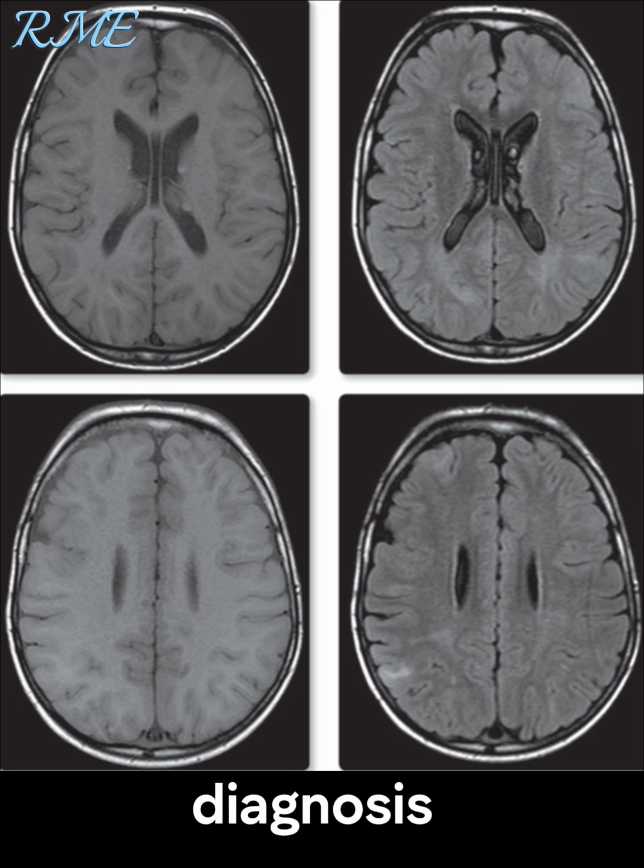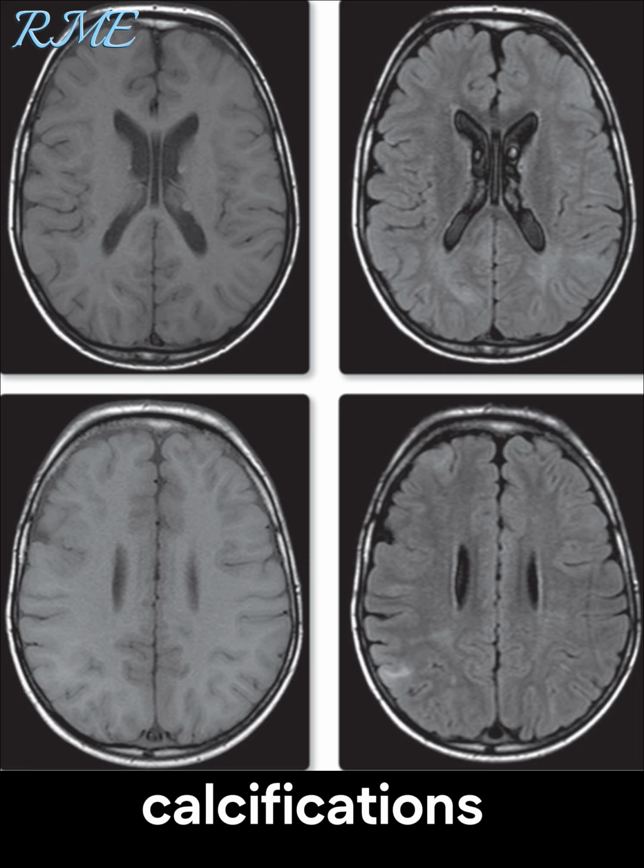The differential diagnosis is extensive, but may be ordered with a simplified surgical sieve. Congenital causes include tuberous sclerosis with subependymal and/or cortical hamartomas and Sturge-Weber syndrome with gyriform lesions. Acquired causes include dystrophic calcifications associated with trauma from injury or previous surgery, ischemic insults, and previous radiotherapy.